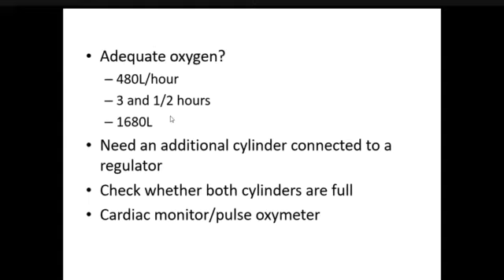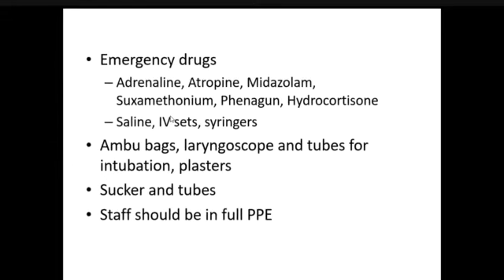And you have to check whether both cylinders are full, right? And you have to take the equipment: cardiac monitor, pulse oximeter, right? And emergency drugs like adrenaline, atropine, midazolam, suxamethonium, right?